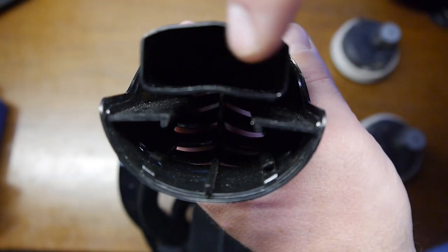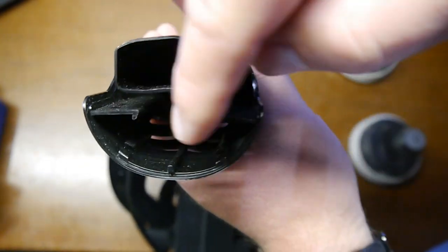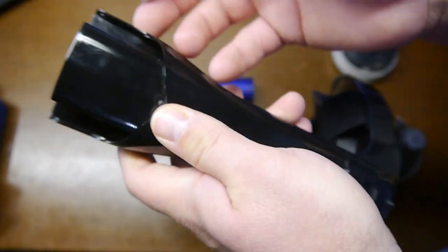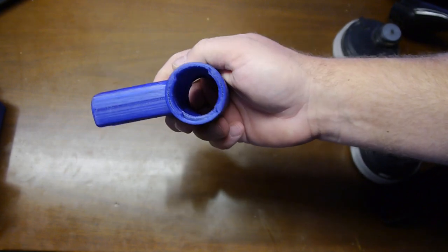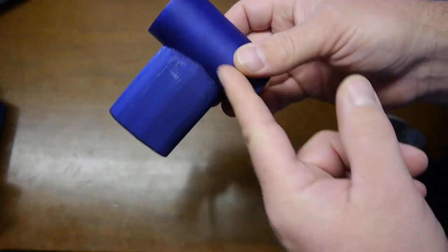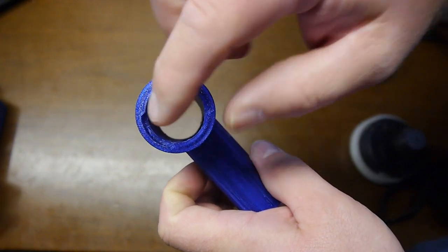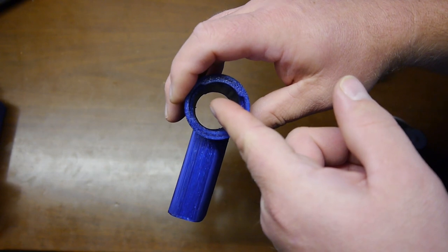Then you just kind of go around with arcs, lines, and splines, zoom in, you know, and draw it out, and that's that. And then you offset for the thickness that you want, extrude, and there you go. Now you have it. It's as easy as that. So yeah, I'll upload a couple variants of this. One where it'll be just this cross section and none of this. One where it'll be this plus a couple different sizes of this. And it'll just be a solid piece, and this will be hollow up to this point.